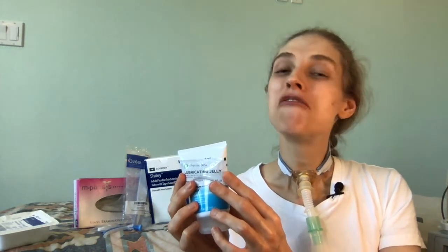Another item you'll need for your tracheostomy tube exchange is lubricant jelly. Lubricant jelly may or may not be included with your home medical equipment company. For me personally, I don't have this provided. However, I've been able to get these little lubricant jelly packets through my hospital. These are wonderful. They're one-time use. You simply open up the top, spread what you need on your tracheostomy tube, and throw the rest away.